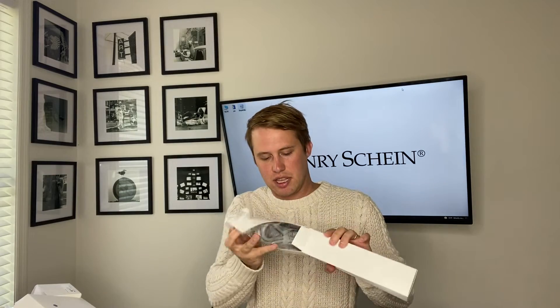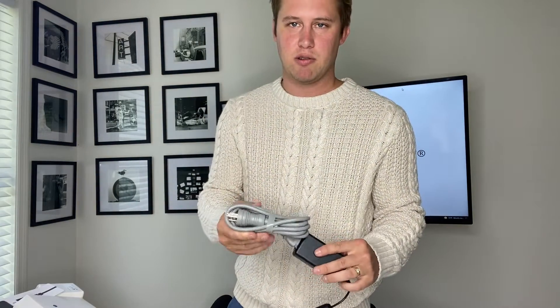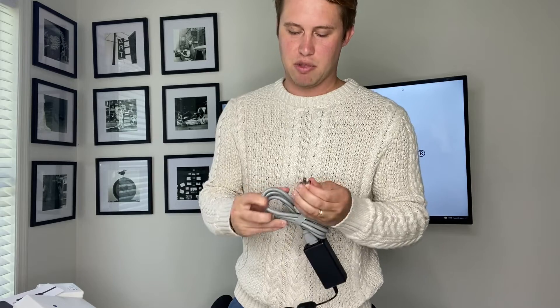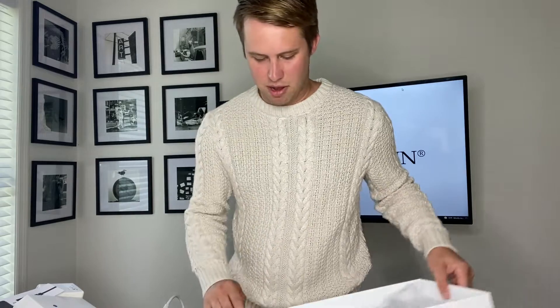Last but not least, we have our power cable that will connect into the jack, ultimately powering the whole unit. We have an outlet plug here, so everything gets connected so our scanner can be powered on.